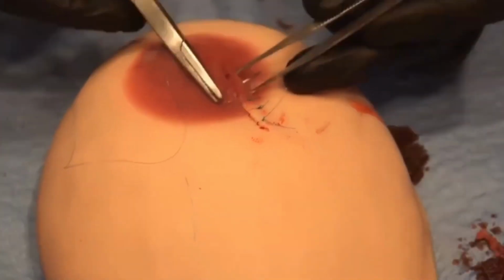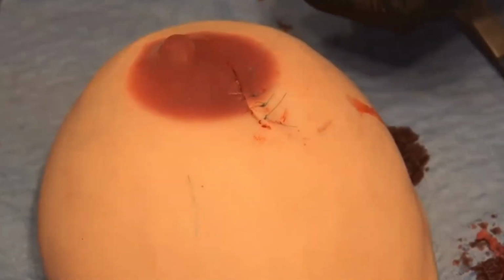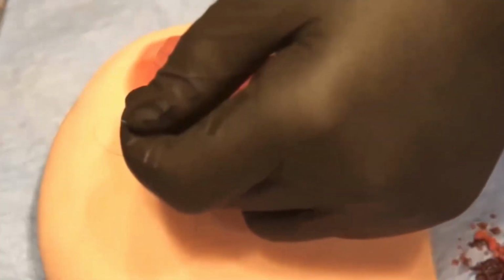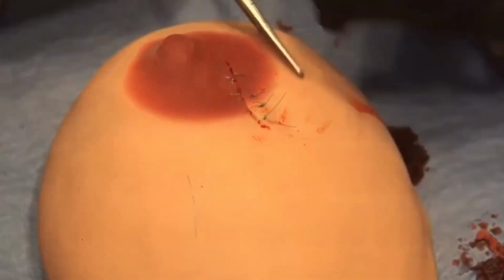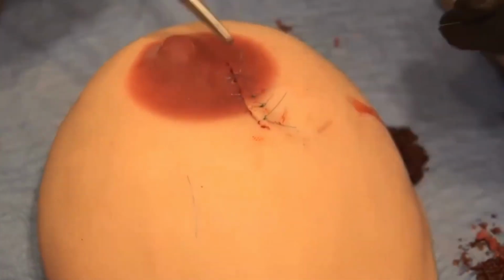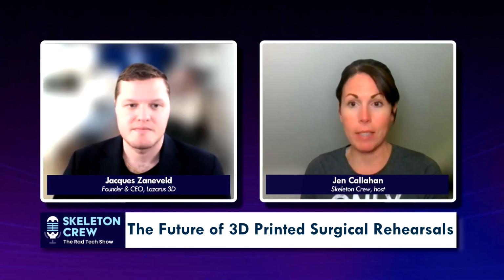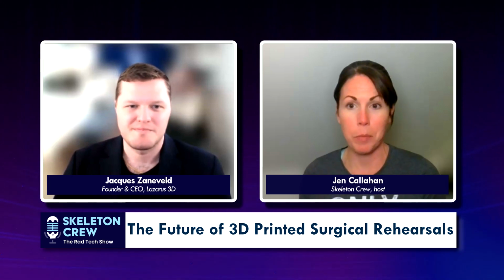One of the new technologies that we developed allows us to control the amount of bonding between different tissue layers. So in reality, our bodies aren't a solid chunk, right? We have these planes that surgeons need to find between different tissues. So that's something that you can see in the model, as well as now a reconstruction where the physician is suturing closed that incision. I'm sure that suturing is a huge thing, learning how to get the skin to line up with each other and, as much as you can, practice, practice, practice.